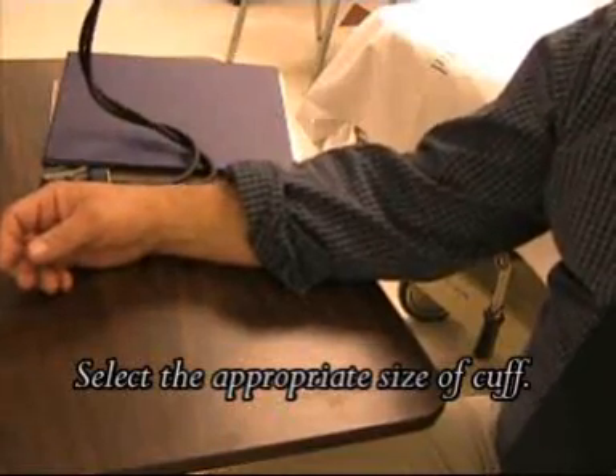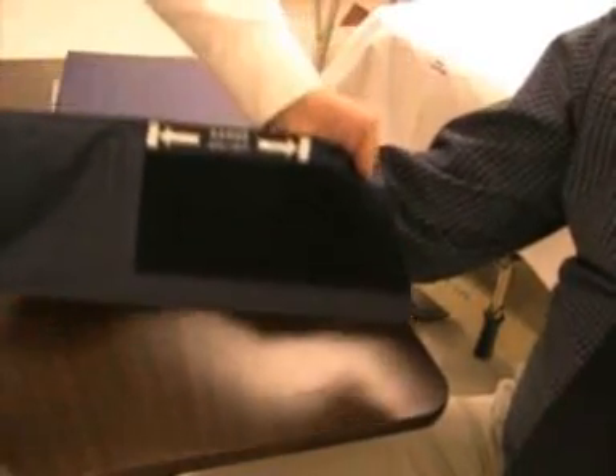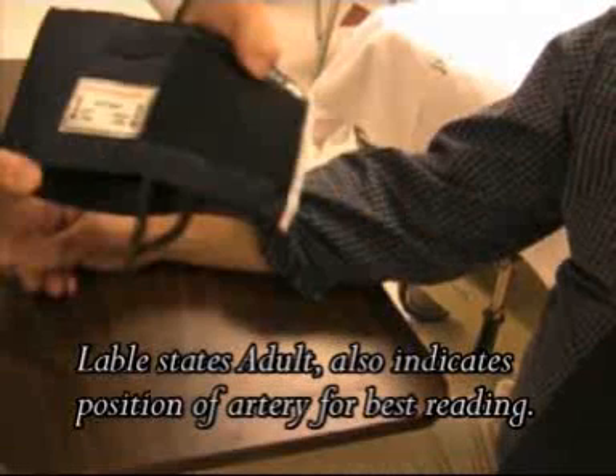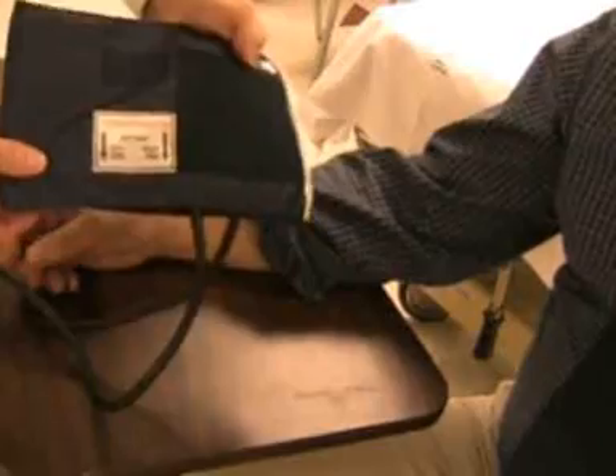Identify your cuff. Make sure it's the right size for the patient. Identify the arterial positioning for that cuff.